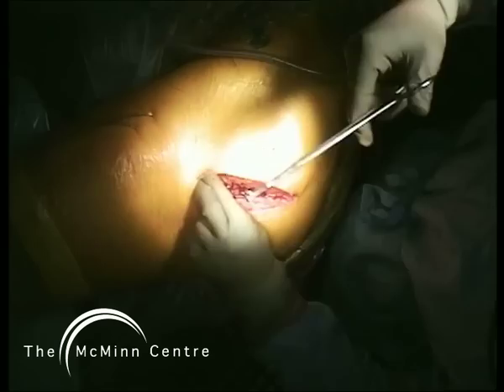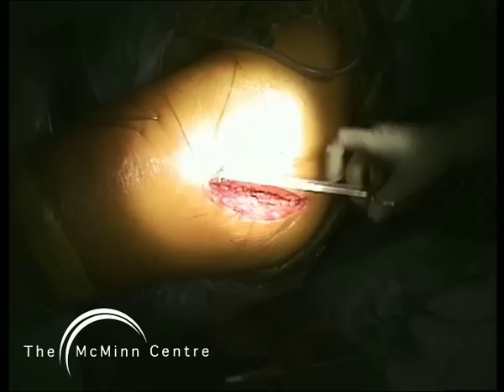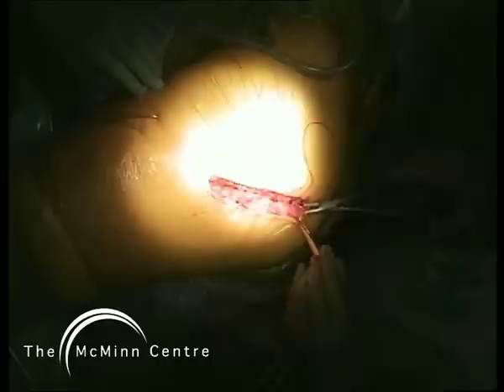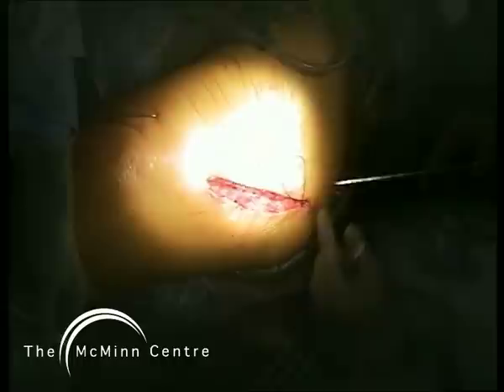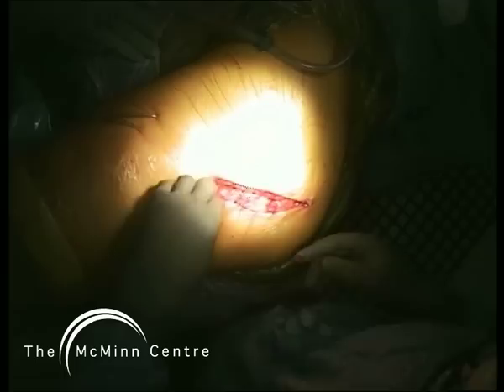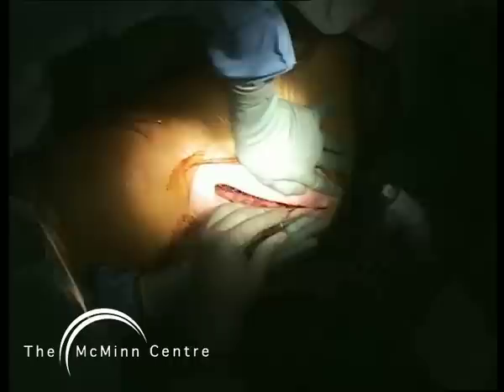We use Vicryl to close the fat layer and clips to close the skin. I use a compression stocking going right up over the hip region for six weeks to reduce post-operative swelling in the leg and hip. This patient will get up full weight bearing tomorrow. I encourage patients to use two elbow crutches for one month and then one stick in the opposite hand for a further month.